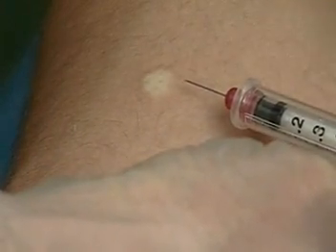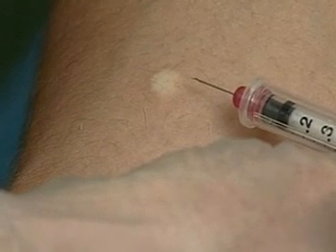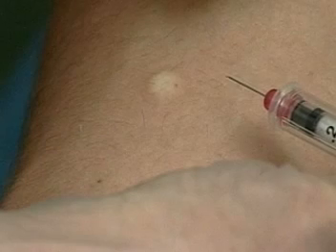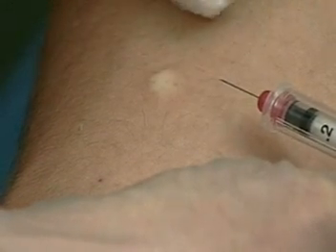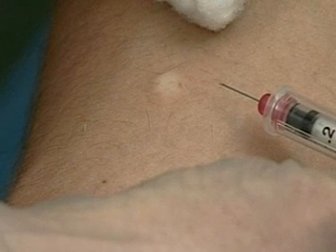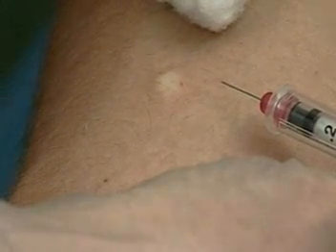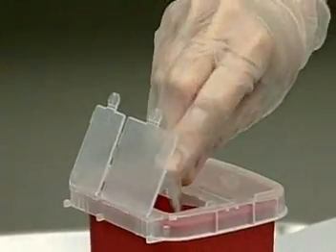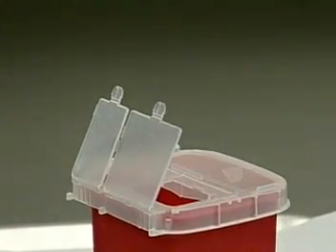Withdraw the needle quickly and smoothly at the same angle that it was inserted. Blot gently with a cotton ball if necessary. Do not massage the site. Massaging can disperse the agent into underlying tissue layers or out through the injection site. Immediately dispose of the safety needle and syringe in a sharps container.